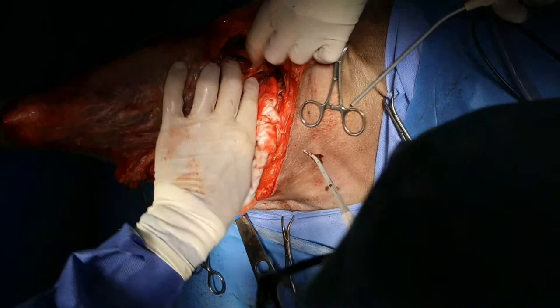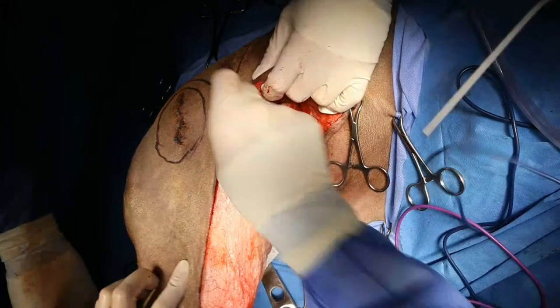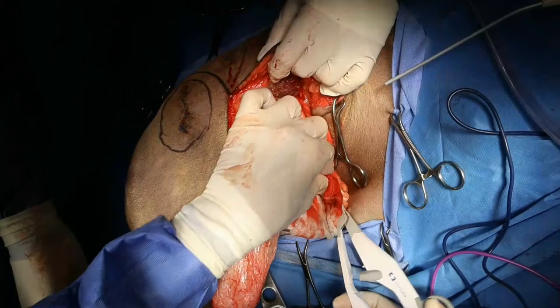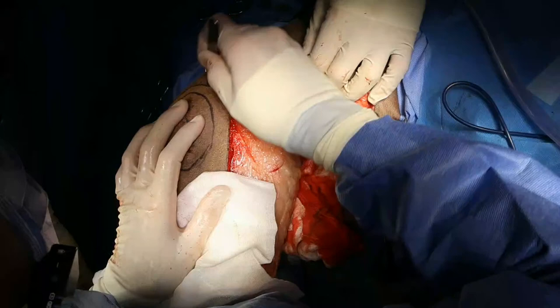Okay, so I'm down to the ventral aspect of the ilial wing, right there. Those tendons really pop. All right, so now we're down to ilial wing here. I'm getting to some gluteal muscles. So I'm just going to incise through my skin some more up here. All right. I don't need to, but I'm going to use a new sponge. Got plenty of room in this one. I'm using it to provide some pressure. So now I'm just cutting around my biopsy incision.